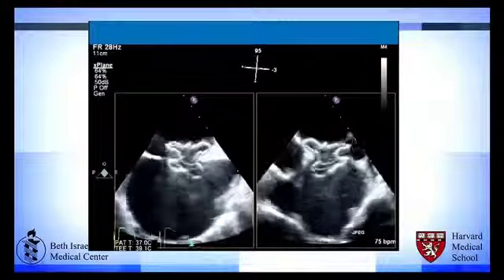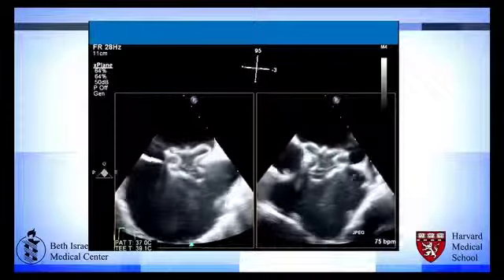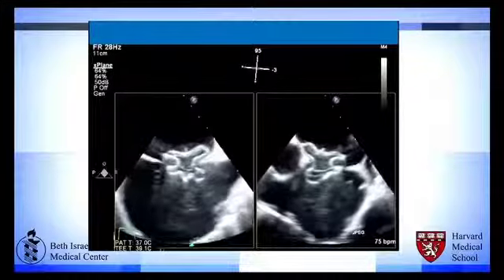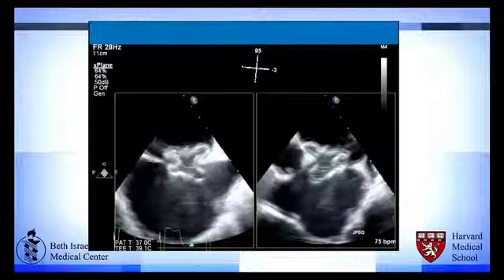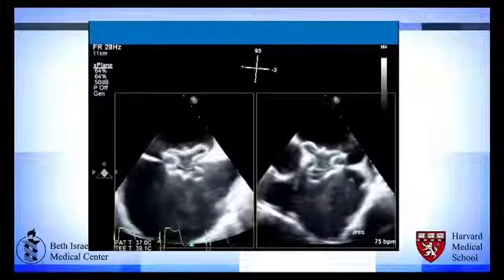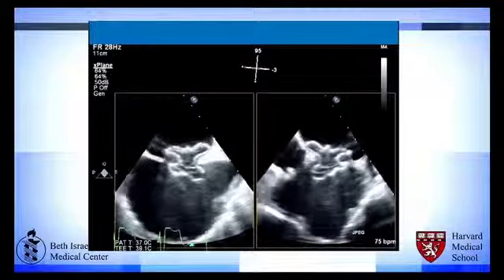This is an atrial septal occluder being viewed in two orthogonal views at 0 and 90 degrees. This is more important than seeing a beautiful three-dimensional en-face view of this atrial occluder device from the left atrial or the right-sided view, because you can see the position of the interatrial septum or a rim around the device in all views.